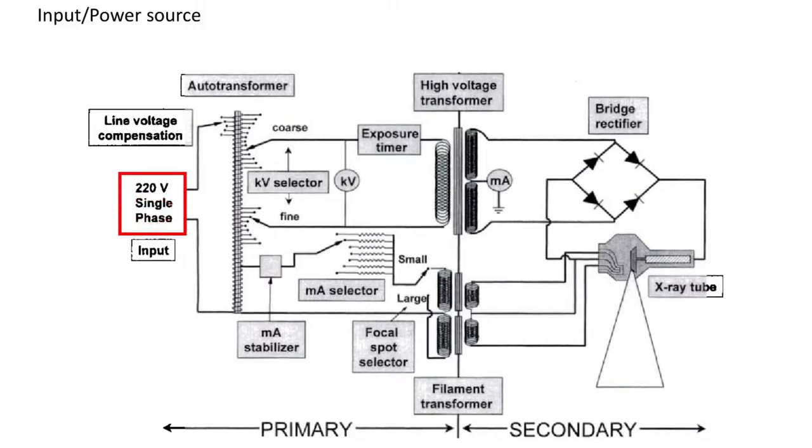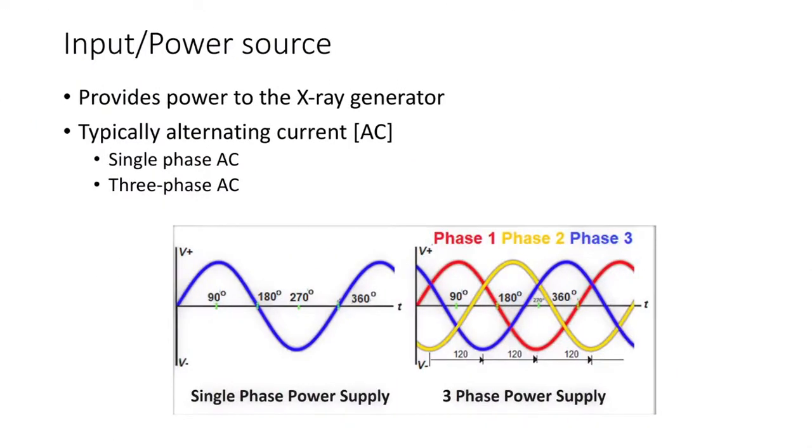It is useful to know that power supplying companies, for the sake of transmission of electricity, supply what is known as alternating current. And this alternating current is used in X-ray production. So the point is our power source would typically be providing us with alternating current.